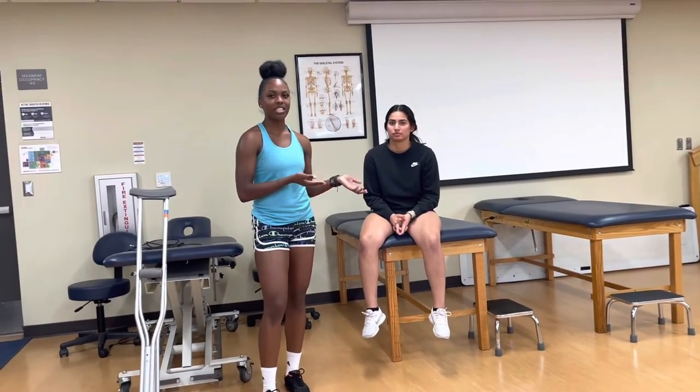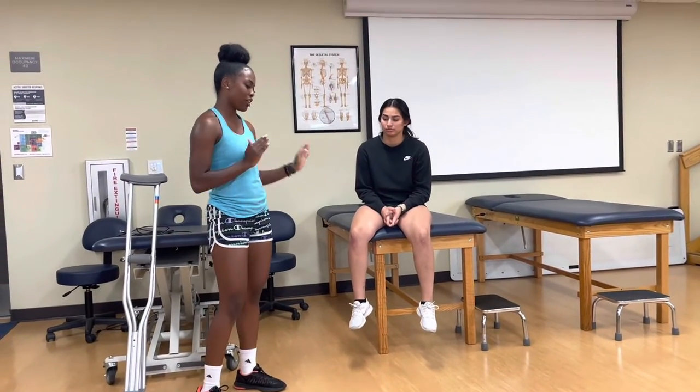Hi, my name is Treasure and today I'm going to be fitting my patient Donna Reese for crutches. Donna Reese has injured her right ankle and so she's completely non-weight bearing on that side.